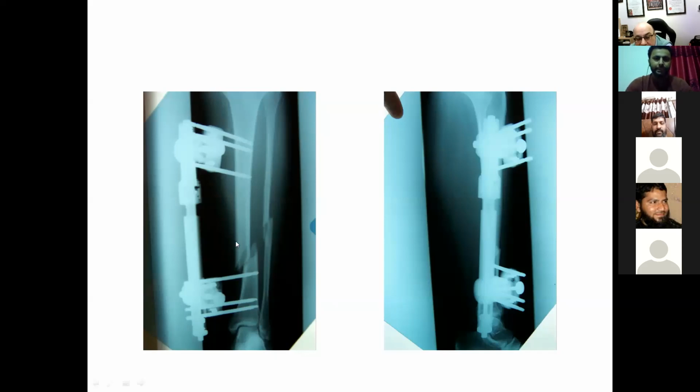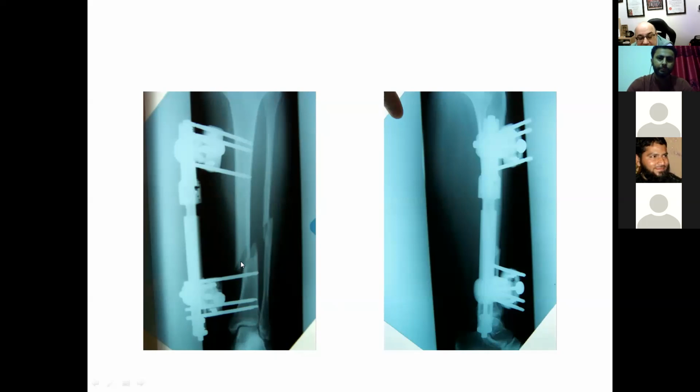Second thing is the fracture is not reduced properly. There's still a rotation element. Yes, sir. Yeah, if you haven't reduced the fracture in the X-fix, this is a disaster, non-union, isn't it? Yes, sir. And third thing is that in the proximal part, we have space. We can apply multiple pins for stability, but he hasn't. Yeah, so this was probably an open fracture, and they've done the spanning, isn't it? Like held it together, come back to a more permanent solution for it.